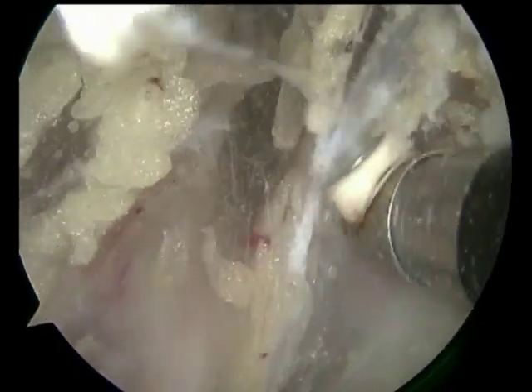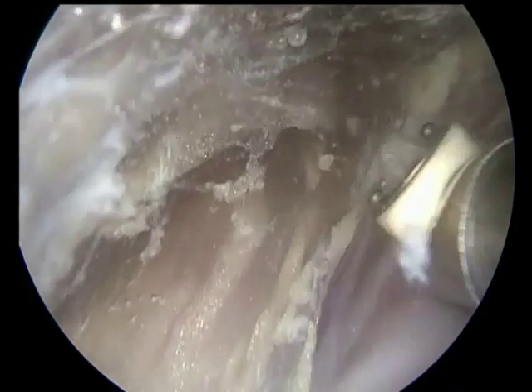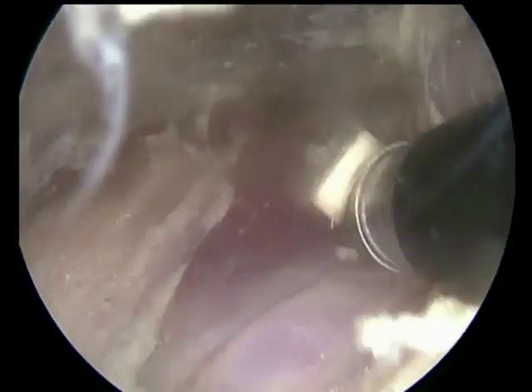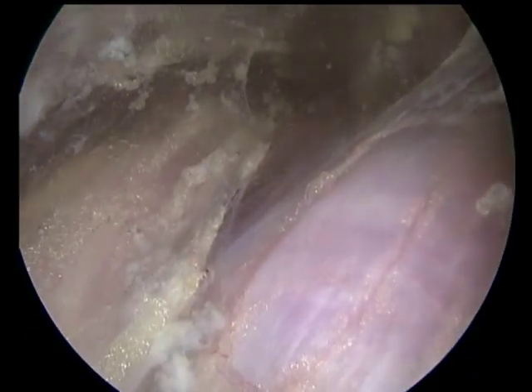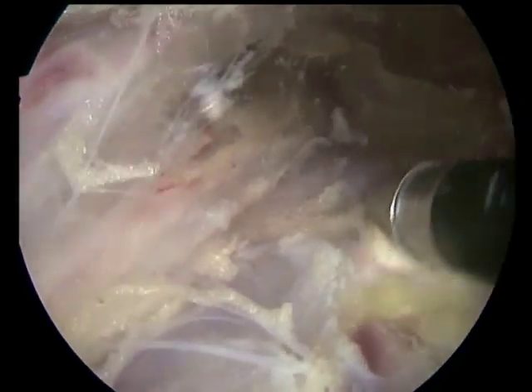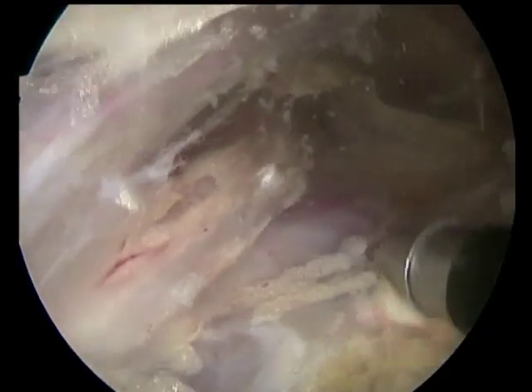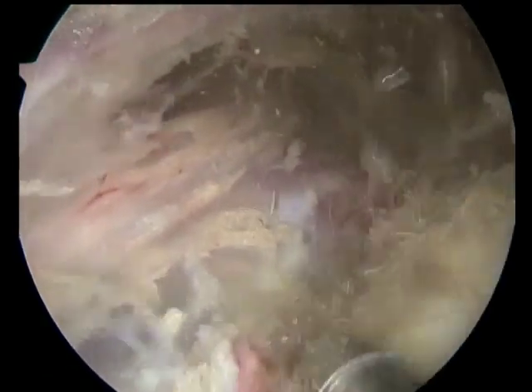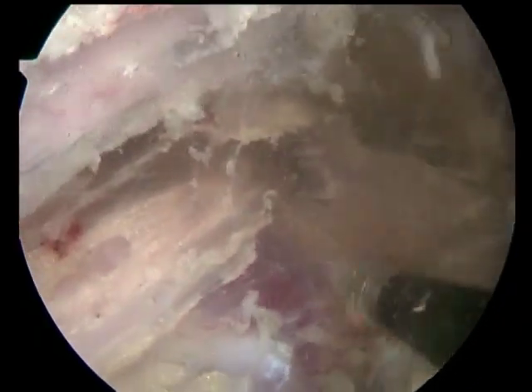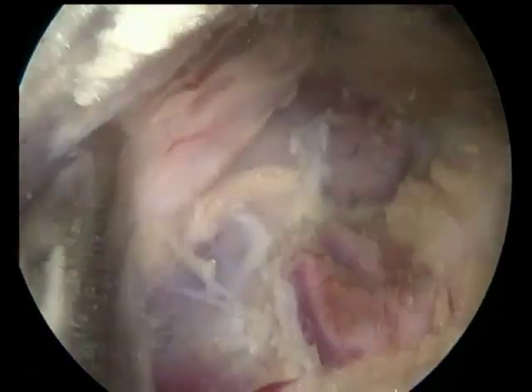So now we continue our release into the proximal direction. We go along longitudinally to the sciatic nerve and we approach to the infrapiriformis space. We can see the rotator cuff muscles of the hip, which are inferiorly from the sciatic nerve. We do the release superiorly to the sciatic nerve, closer to the piriformis muscle. We do a small myotomy of the rotator cuff muscles, of the rotator hip muscles, to decrease tension and to increase the space of infrapiriformal space.